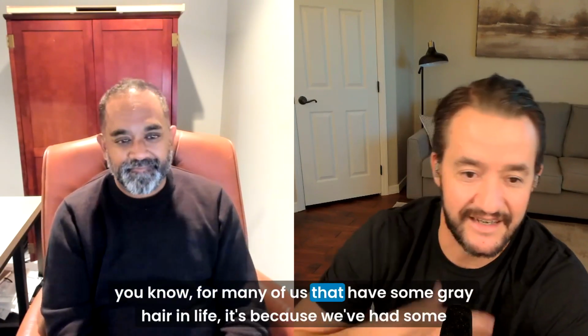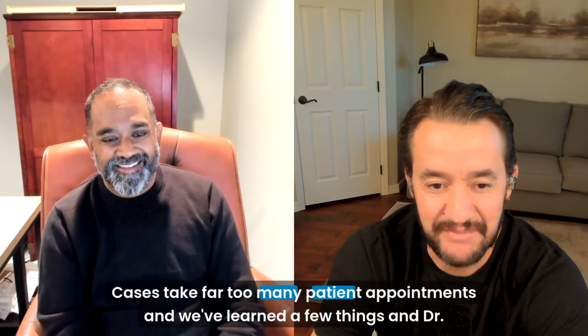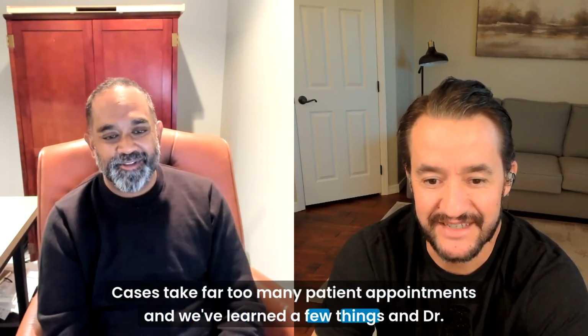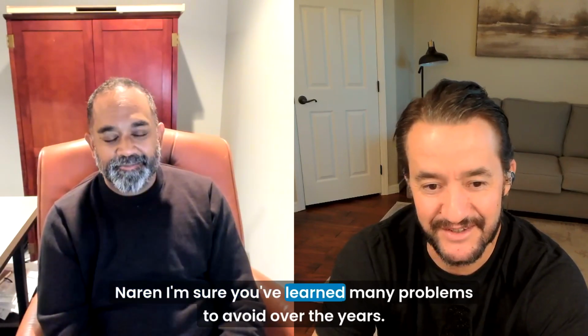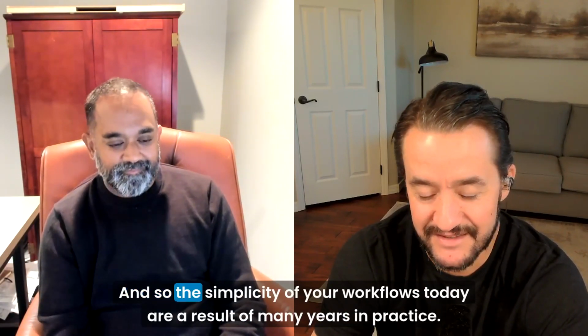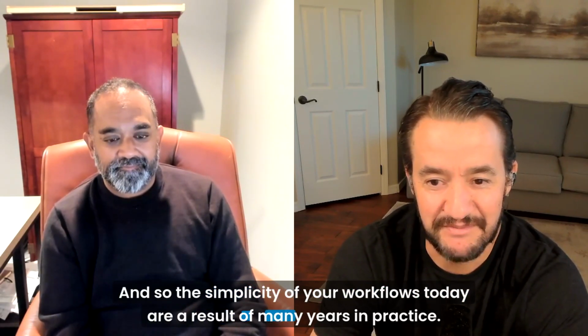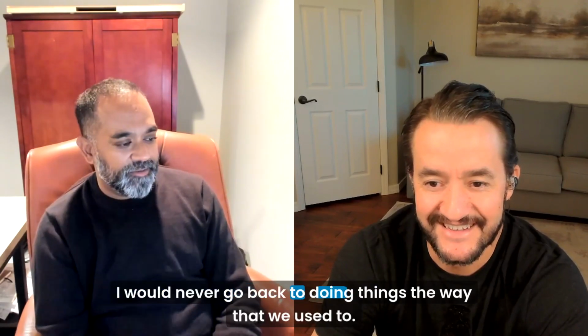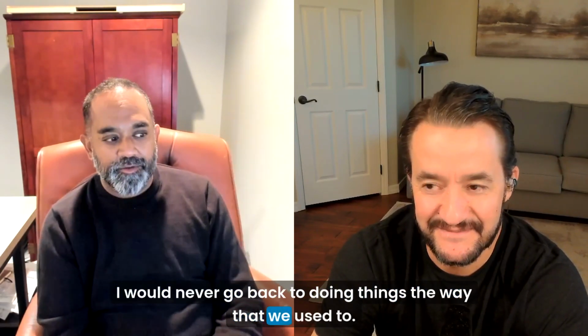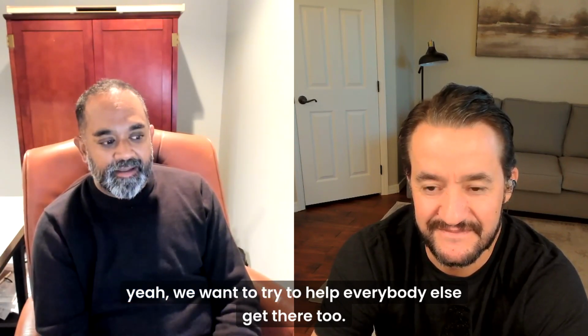For many of us that have some gray hair in life, it's because we've had some case failures, or cases that took far too many patient appointments, and we've learned a few things. Dr. Naren, I'm sure you've learned many problems to avoid over the years, and the simplicity of your workflows today is a result of many years in practice. And I would never go back to doing things the way that we used to. We want to try to help everybody else get there too.